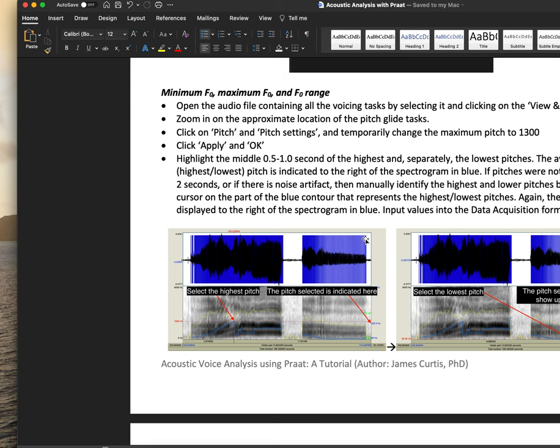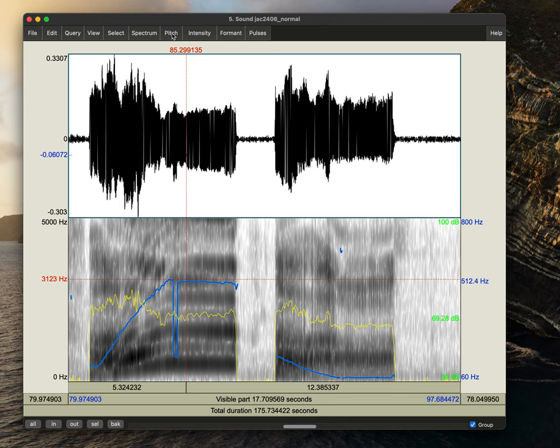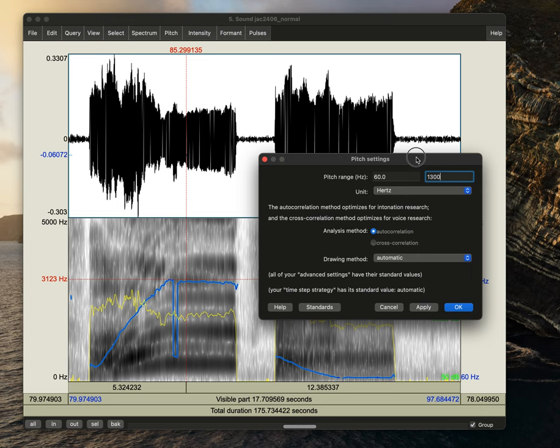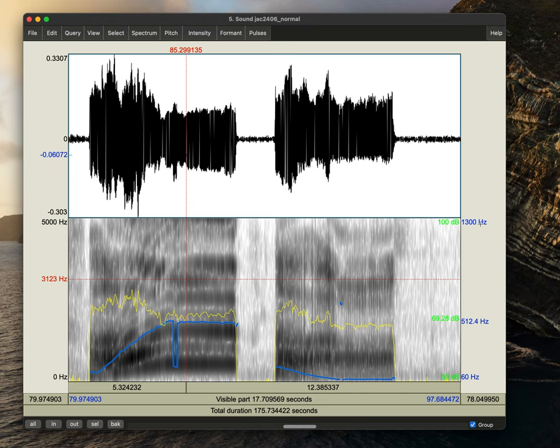You might not always get that. So to look at our pitches, the first thing we're going to want to do is temporarily change our pitch settings. So we're going to go to pitch settings. We'll change this to something higher. This is going to be especially necessary if you're working with singers. Then we'll select apply and OK.